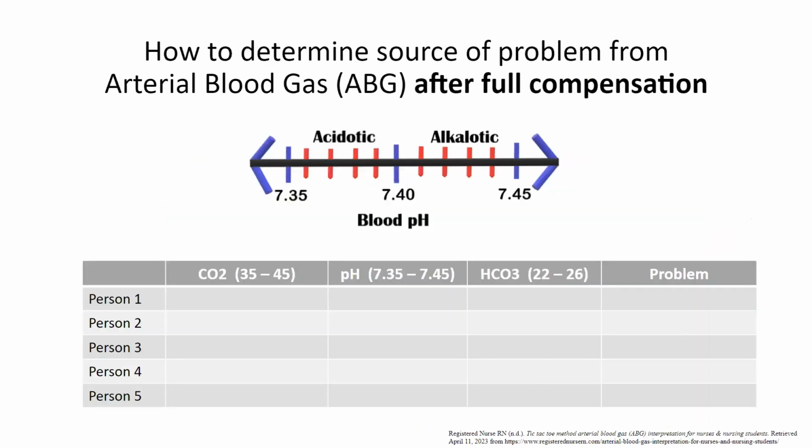Now I want to quiz you a little bit and make sure you understand how to determine the acid-base imbalance caused from fully compensated ABG values. Now keep in mind, this is only one piece of data, and in the clinical setting, you'll have the patient with signs and symptoms and other diagnostic results to guide your understanding of their condition. But you do need to understand ABG results and what they mean. And you'll have to answer test questions without other data to guide you.